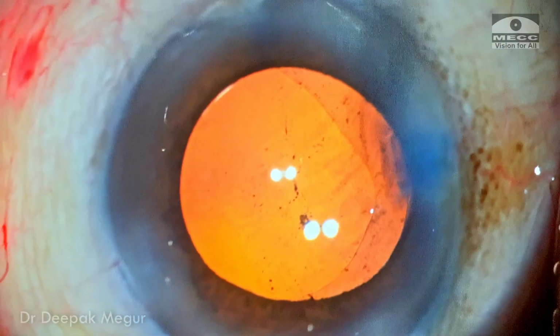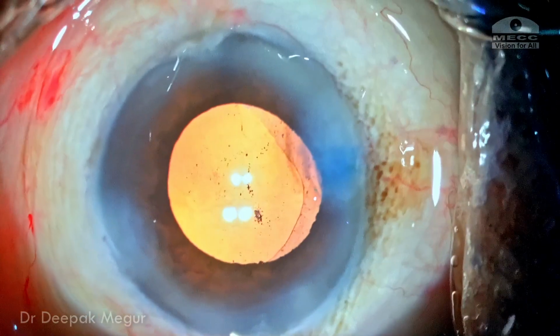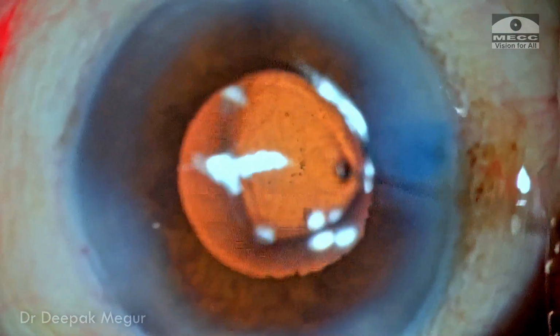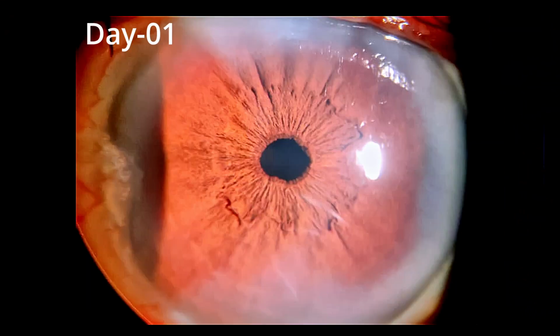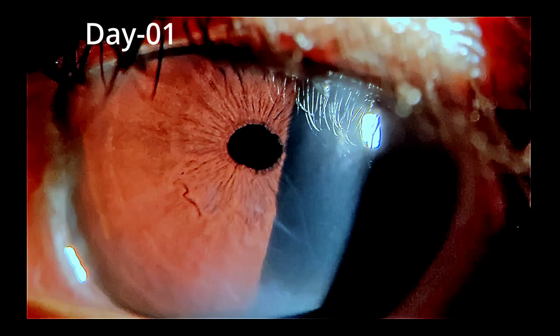The lens looks to be very well centered and stable. Time to close. The side port and the main incisions are hydrated, intracameral antibiotics are placed. That's it. So these are the next day post-op pictures. There's very minimal corneal edema, thankfully, and the patient was quite happy.